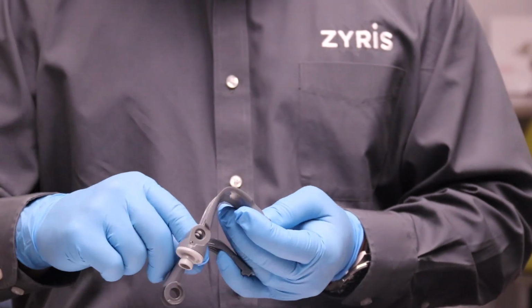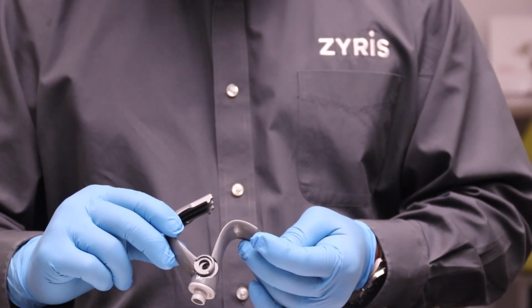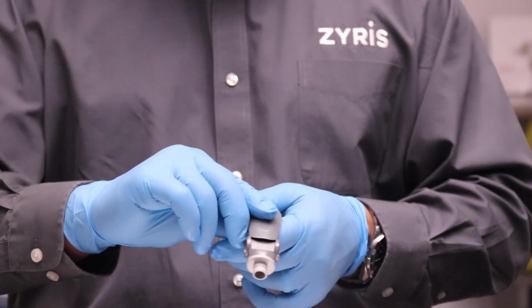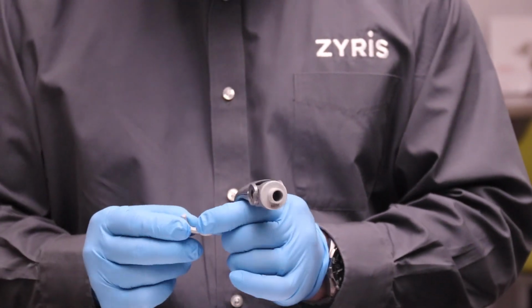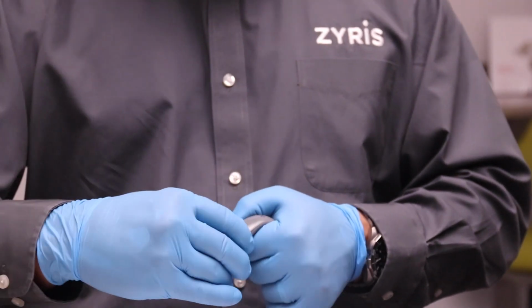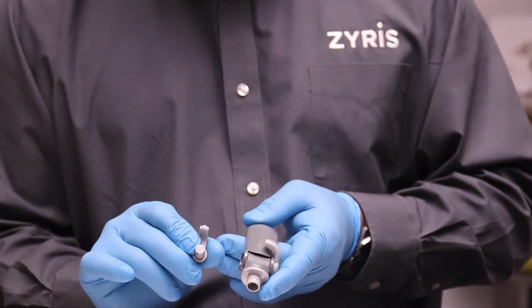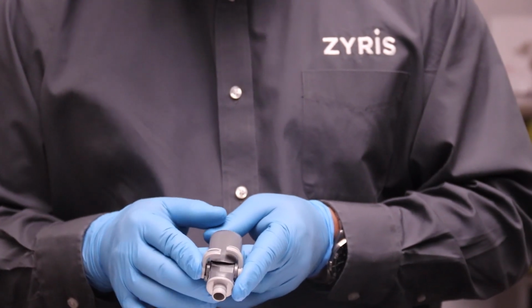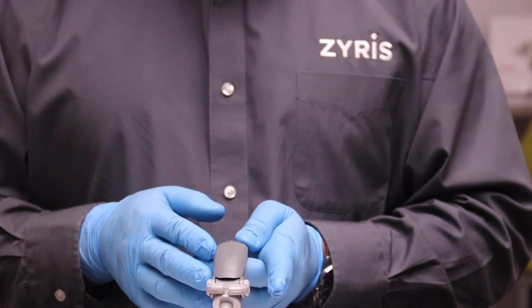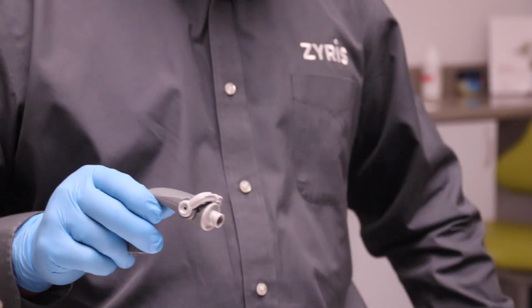Now, to reassemble the control head, take the upper and lower portions, attach the base first, align the two halves together, and then click them closed. Now you can take your levers, being mindful of which is right and left, and place them onto and over the back of the core posterior control head. Make sure that they're pressed in all the way and that they're operating smoothly. Now your unit is reassembled and can be placed back onto the HVE hose.